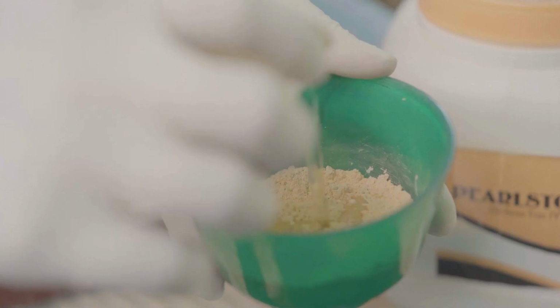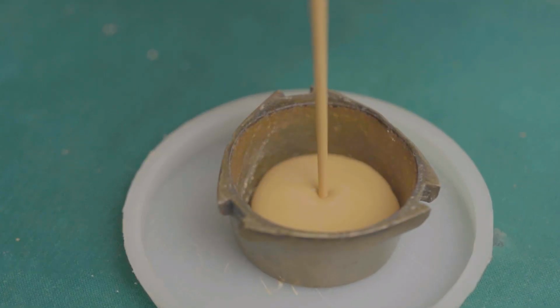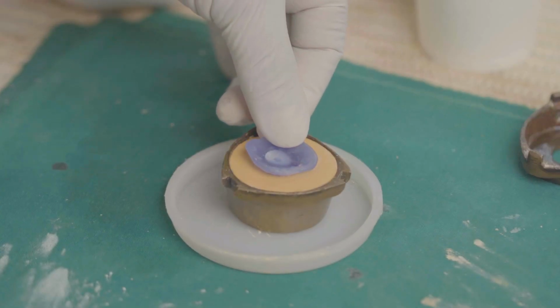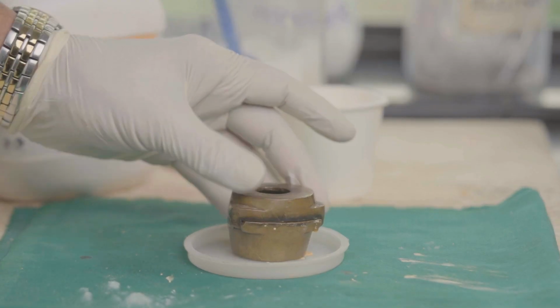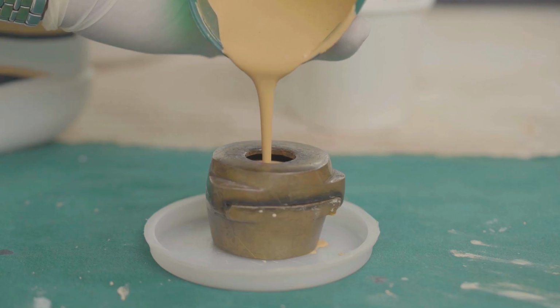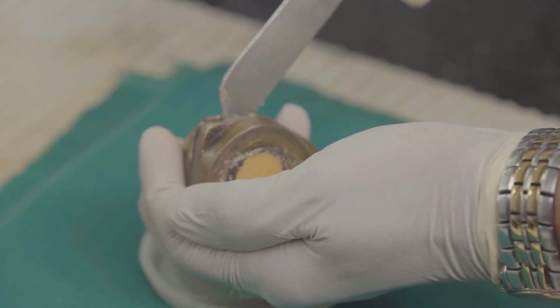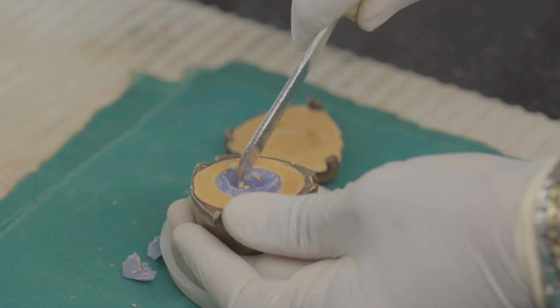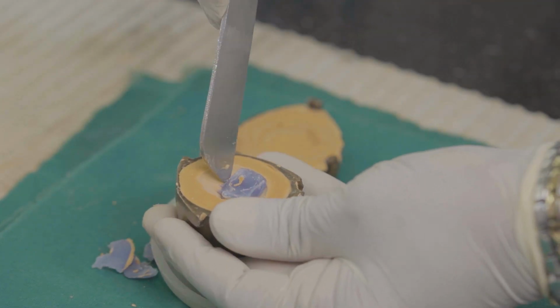Plaster of Paris and dye stone powder in a ratio 3:1 along with water is made into a paste. This paste is filled in an eye flask up to the rim. Then the wax model with the corneal button is placed in the flask and allowed to set. Again, the plaster is mixed and filled into the other half of the flask. It takes about half an hour to set, and once it is set, the corneal button along with the wax is scraped out. Now the plaster is ready for acrylic casting.